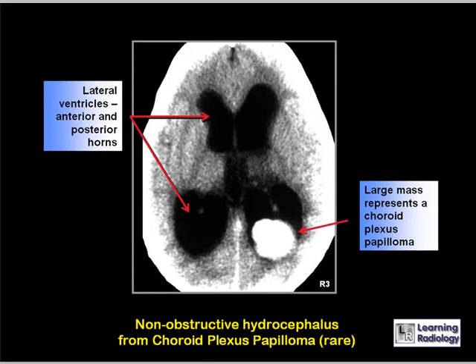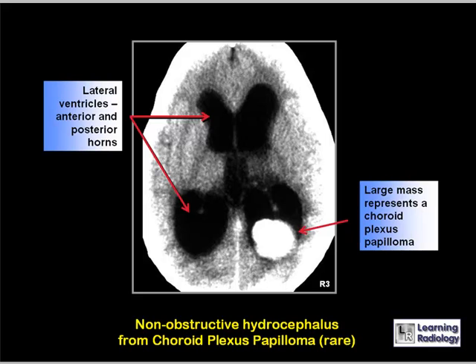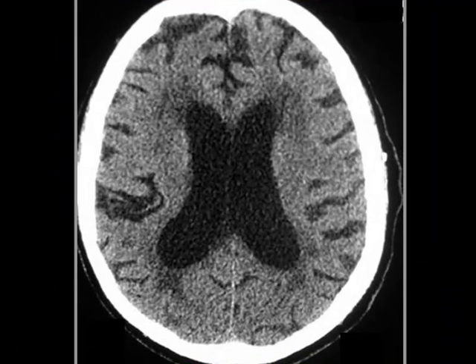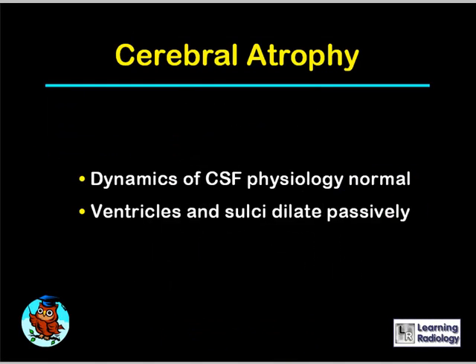This is non-obstructive hydrocephalus produced by a choroid plexus papilloma — this is rare, and the large mass to which the red arrow points represents the choroid plexus papilloma. The ventricles are markedly dilated, both the anterior and posterior occipital horns. In the case of the 63-year-old with change in mental status, the lateral ventricles are enlarged but there are also enlarged sulci over the convexities — this is cerebral atrophy, in which the dynamics of CSF physiology are normal and the ventricles and sulci dilate passively.